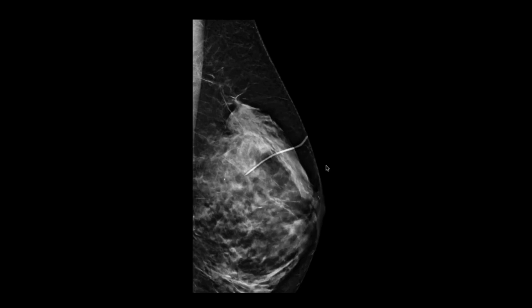So again, it's really important that as part of the protocol, the technologists are really consistently asking the patient, even if they're not maybe marking it on the history sheet that we ask the patients when they come in. The technologist still should be reinforcing and checking that sheet to verify. The patient was, of course, very relieved that we were able to correlate and tell her it was just her surgical scar. But again, she had to take off work.